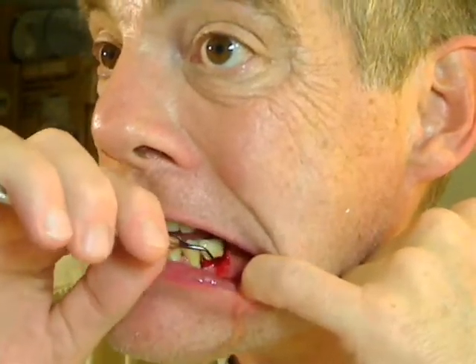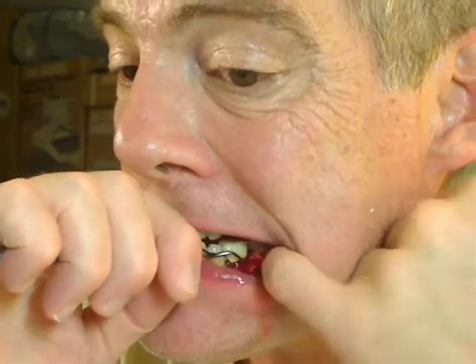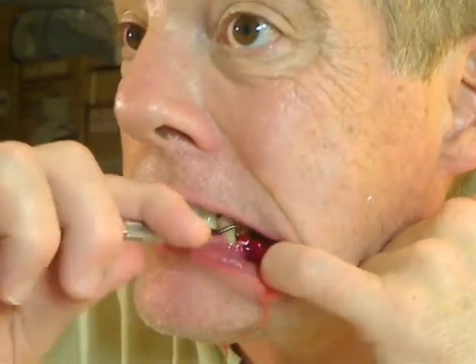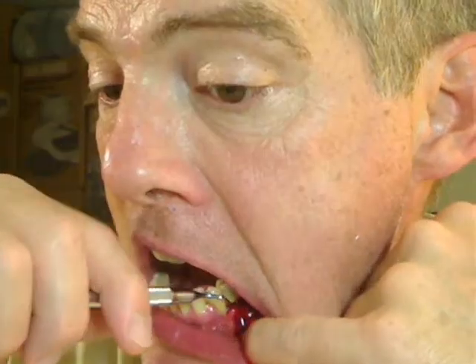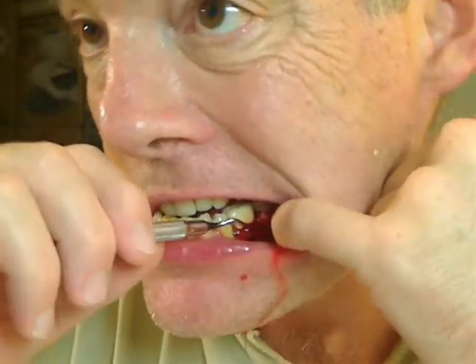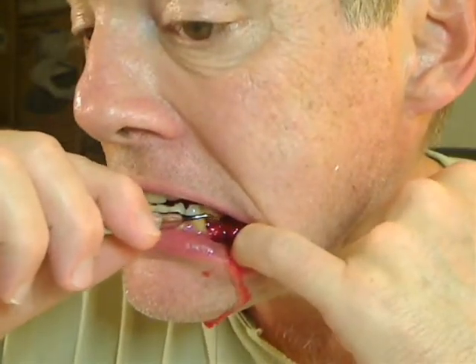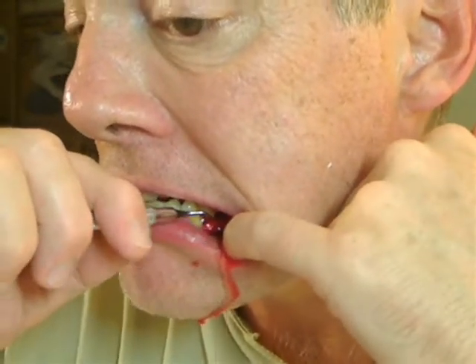Just stick the thing in there and it starts to bleed. Let's try to smooth this out — just stick the thing in there and let it bleed. There it goes. Certainly there's a lot of unsmoothness here.